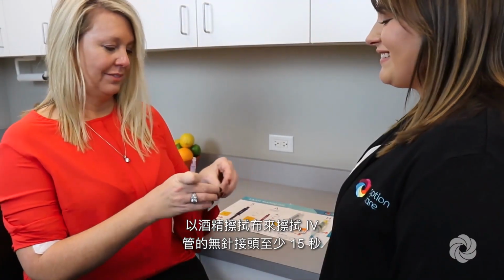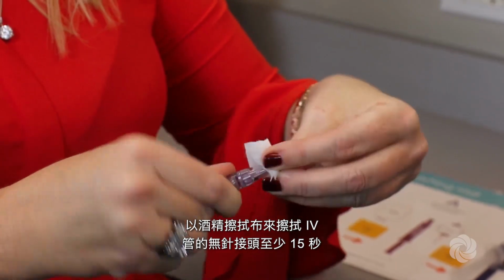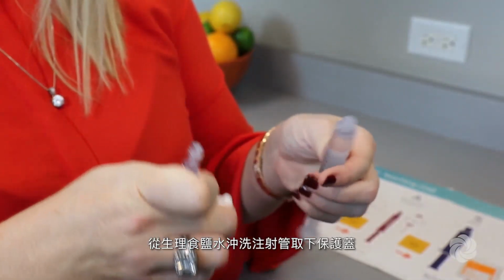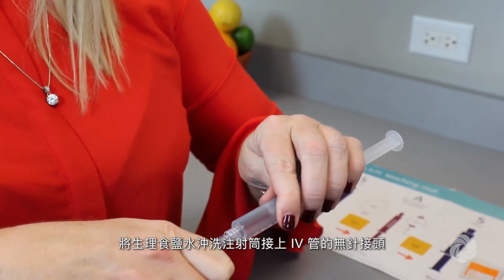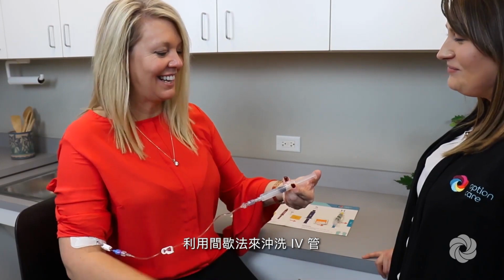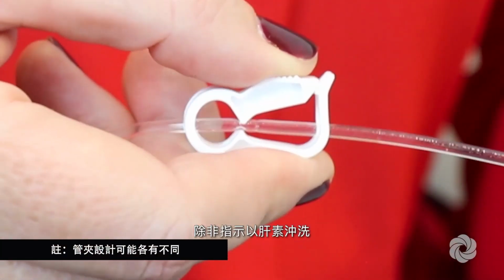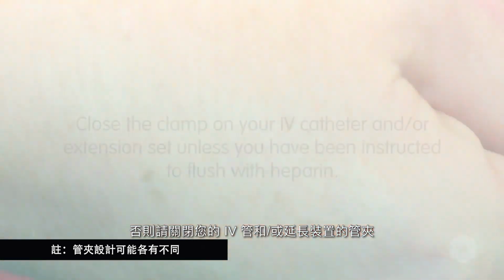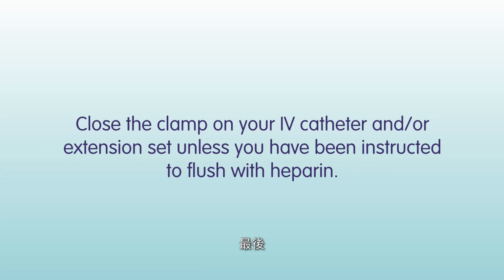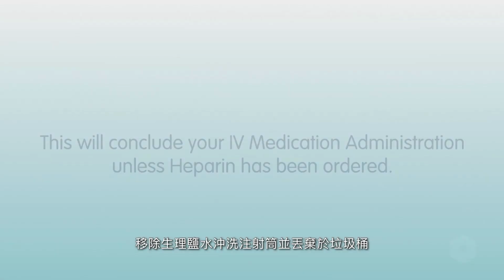Scrub the needleless connector on your IV catheter with an alcohol wipe for at least 15 seconds and allow to air dry. Remove the protective cap from the saline flush syringe. Attach the saline flush syringe to the needleless connector on your IV catheter. Flush your IV catheter using a push-pause method. Close the clamp on your IV catheter and/or extension set unless you have been instructed to flush with heparin. Lastly, remove and discard the saline flush syringe in a trash container.